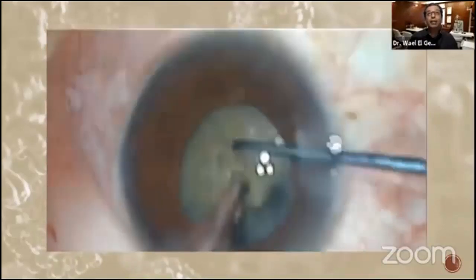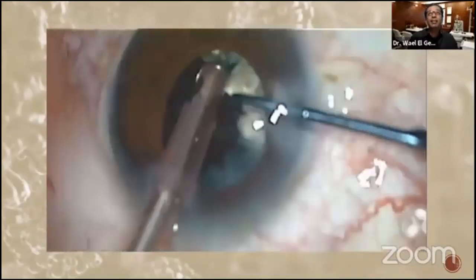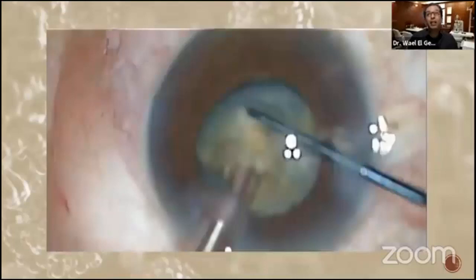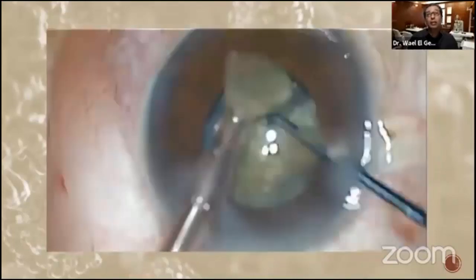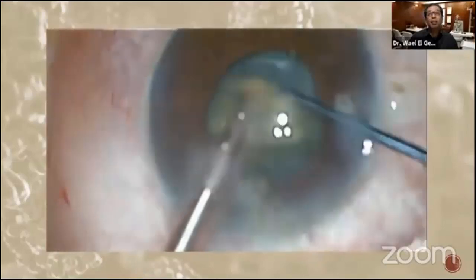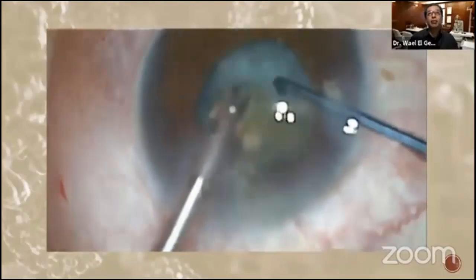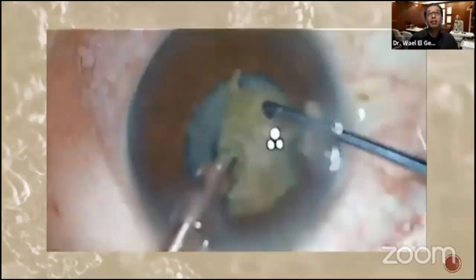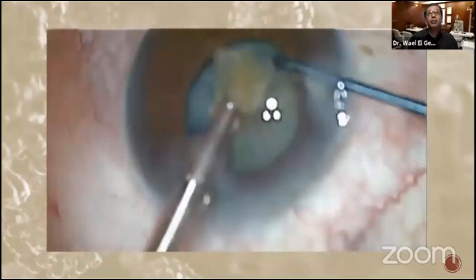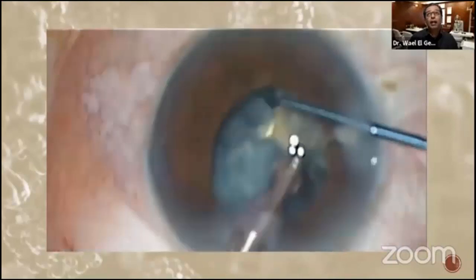Now I'm going to address the half that didn't divide, and I'm going to divide it, splitting the fibers. As you can see, I'm trying to split the fibers anatomically and chop again one quadrant and chop it into a smaller quadrant and then chop it again to a smaller particle, and with vacuum and small bursts of pulsed Phaco, I emulsify, high vacuum as used, as you can see, and chop again. I don't wait for a large particle to be emulsified. I chop anything I hold, I chop.